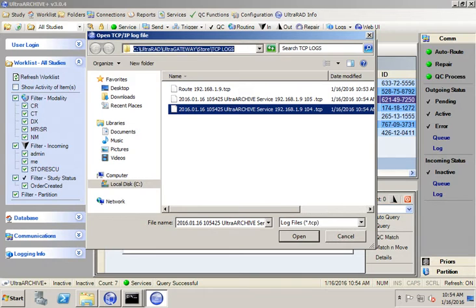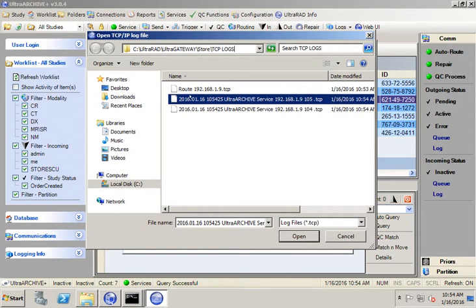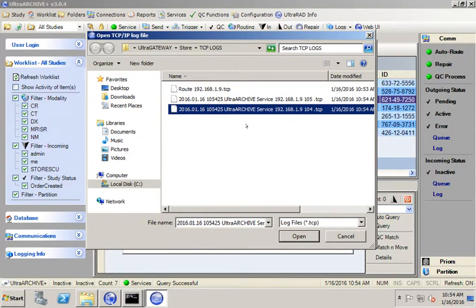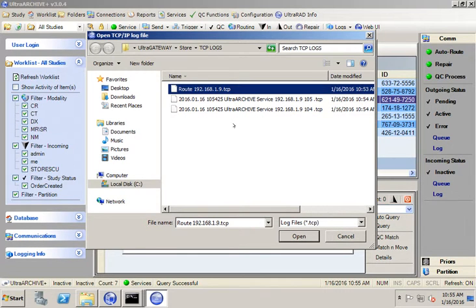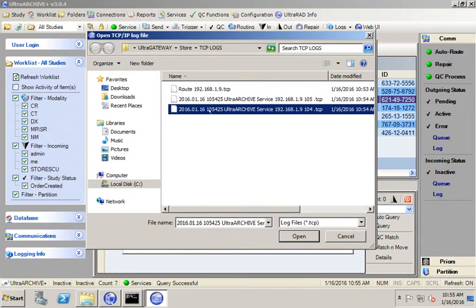By default, your TCP log files will be stored in your working directory for the Archive Plus. Whatever the default directory is for storage of DICOM data, that's where you'll find your log files. It should automatically put you in that directory when you click to look at the log files. In my case, I have 3 log files. There is one for port 105, one for 104, and one for traffic that I am routing or sending. You will always find one log file for each IP address and each port number. So if I were listening on 4 IP addresses, I would see a lot more log files in here.